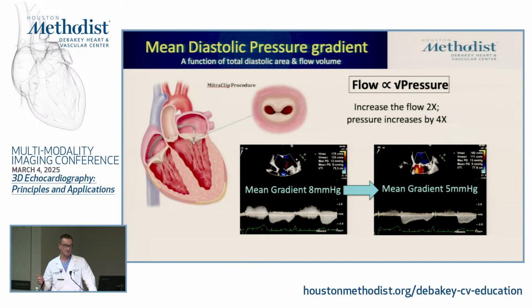With the case at all, or with the second clip? I guess both. In the example that we were just talking about, if the valve area is a little smaller and there is somewhat of a gradient, how do you determine whether to take them?